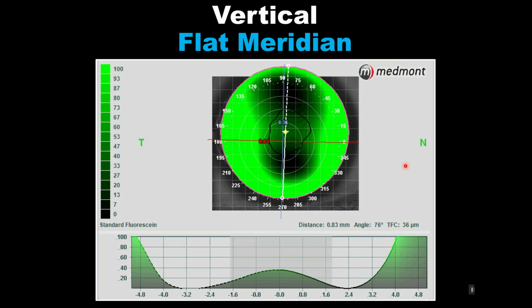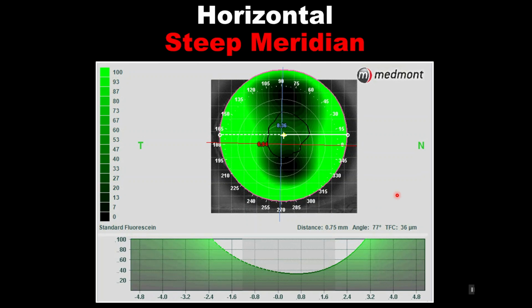And what we find, of course, is with the against the rule orientation, a lens that wants to land at 12 and 6 o'clock. And with that extreme drop in elevation, arcuately from 9 o'clock all the way around to 3 o'clock, it appears we could be in big trouble, especially heading south. You notice the fluid layer is getting exceptionally thick, and that's going to likely cause the lens to want to just fall into this point of least resistance.